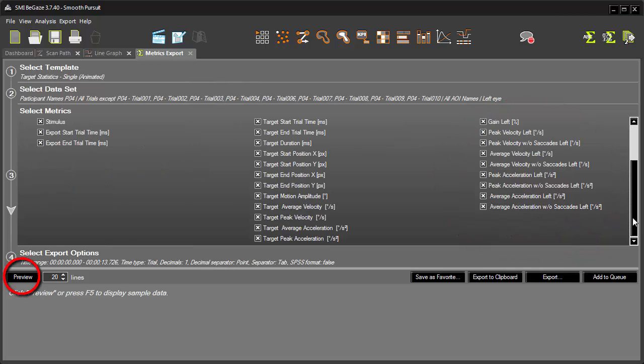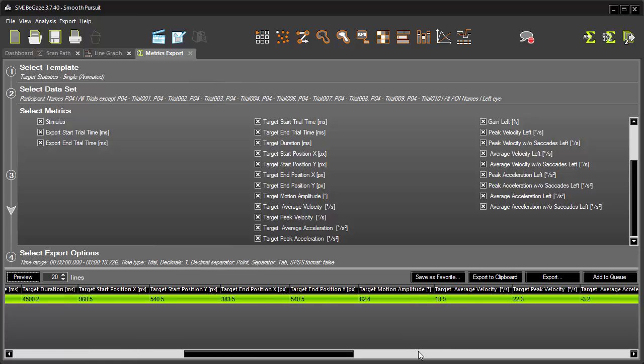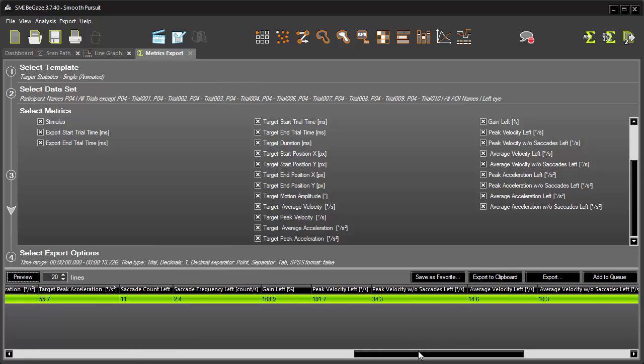Finally, I'll click Preview to display a sampling of the exported data. Here's all the various metrics we selected, appropriately filtered and applied.